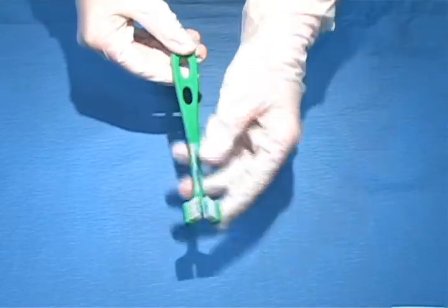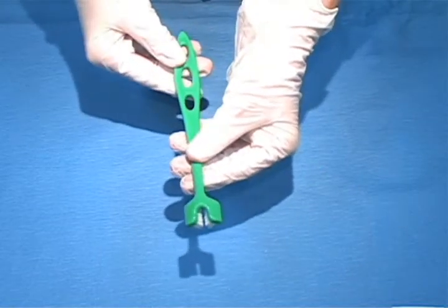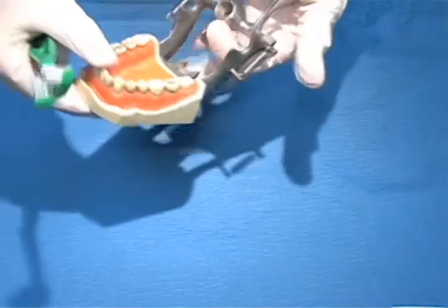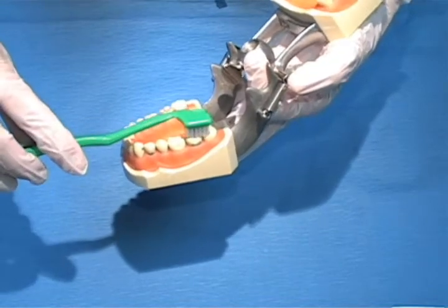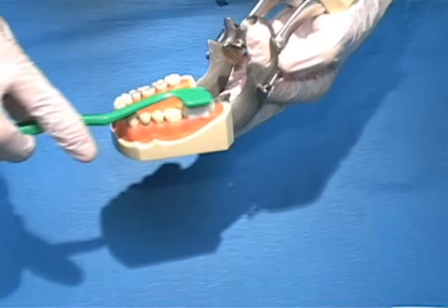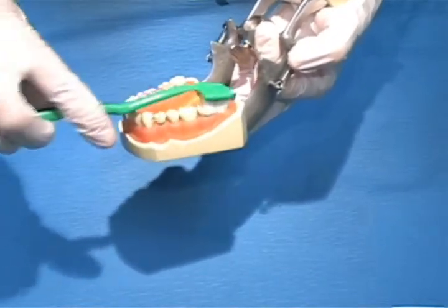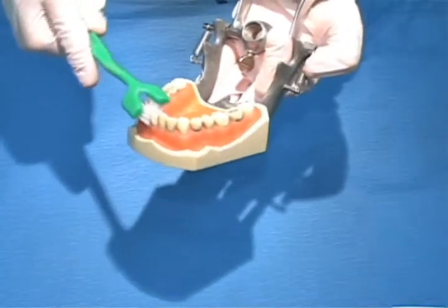The twin head toothbrush also cleans three sides of the teeth at a time. You can see it's a little bit different design. It's good for people who have some missing teeth because when you place the toothbrush on, you don't have to adapt it as carefully as you do with the Collis Curve toothbrush. You can just put it on the teeth and again use a back-and-forth motion — not a long motion, but a short motion going around the teeth.